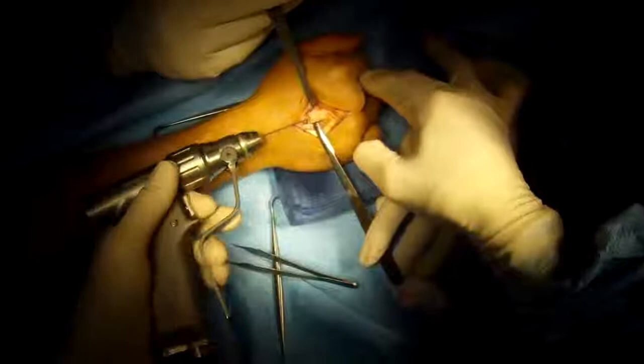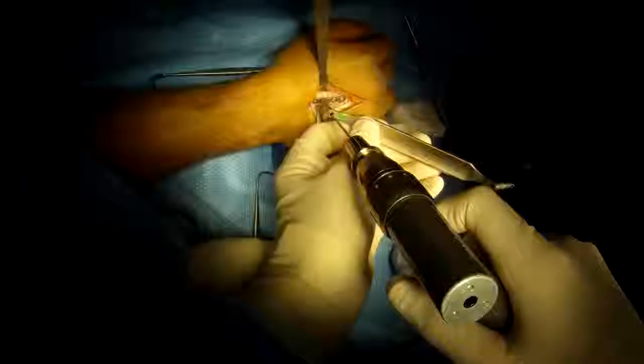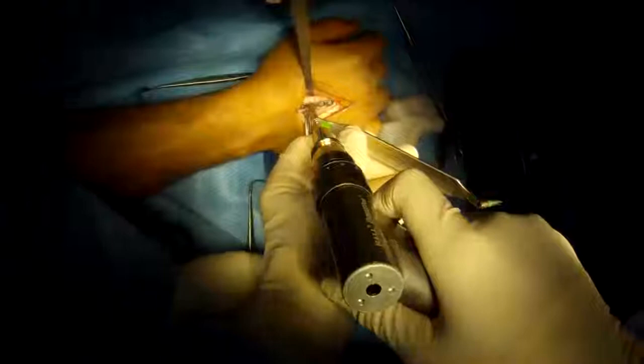We're going to use a provisional fixation — just place a wire there to hold it in position, to keep it stable while I plate it. This allows me to position everything optimally. I'm holding it with a clamp and I pass the wire across the fracture side which holds it in position.